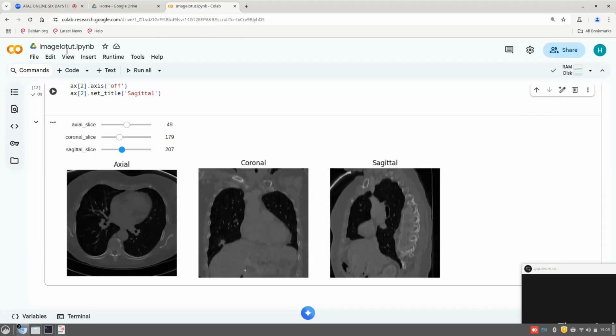And you can use the imageio library or the PyDICOM library. Generally, the images will be stored in DICOM format in any hospital X-ray machine output. You will also get JPEG or PNG images nowadays. With digital X-ray in a lot of facilities, software has come up where the X-ray image can be exported as JPEG and PNG images. But ideally, for all medical image communications, the recommended world standard is DICOM format for any hospital information system.